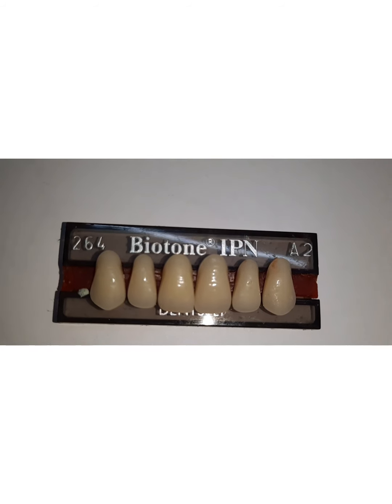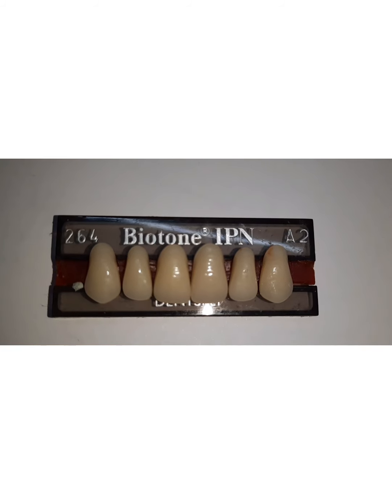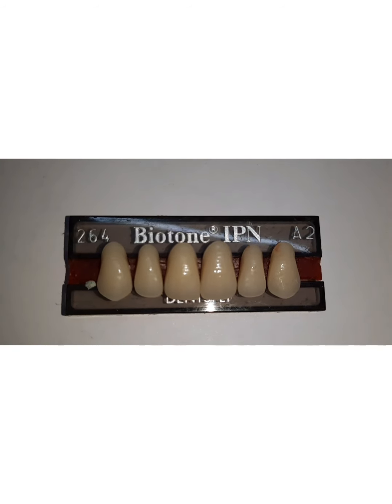Another thing is they can be easily retained with the acrylic denture bases chemically, and that is a very big advantage over porcelain teeth, which are retained mechanically.